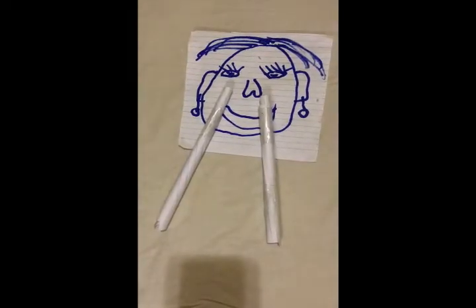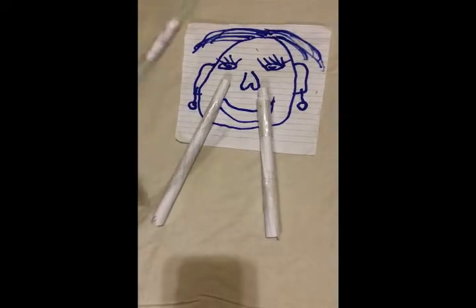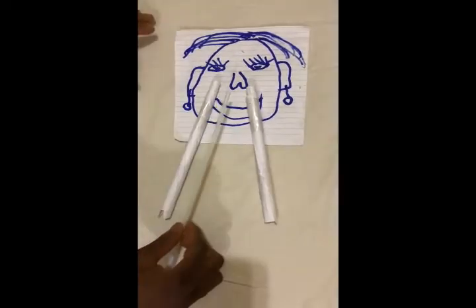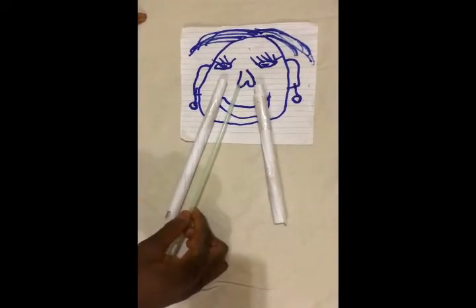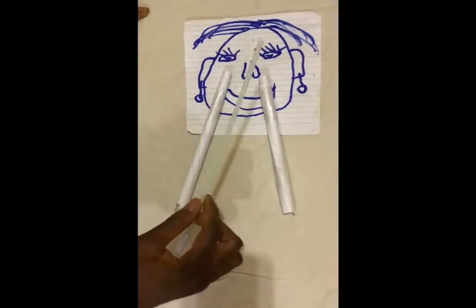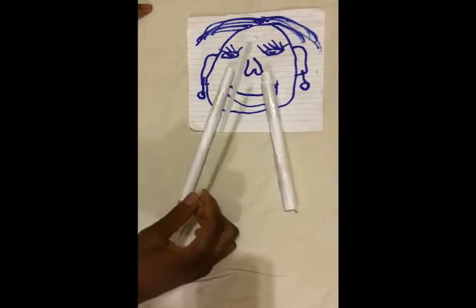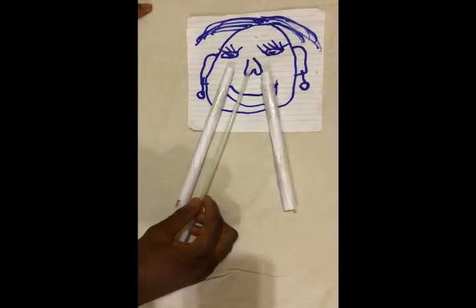Okay. Thank you, madam. Now, the first step is to choose the correct size of the nasopharyngeal airway tube. You do that by comparing with the nares of the patient. You choose a nasopharyngeal airway tube that has a diameter slightly smaller than the patient's nose.